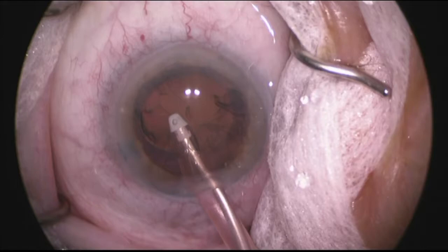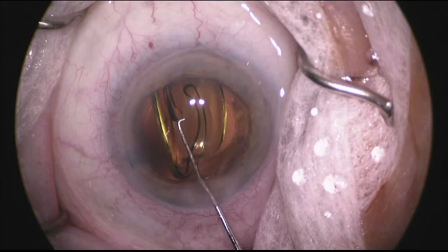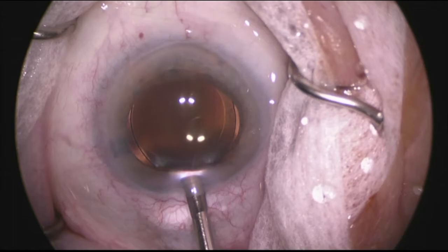The chosen implant is then injected into the capsular bag and rotated into place. The ECP probe is then inserted into the sulcus, and approximately 200 degrees of ciliary processes are treated with 350 milliwatts of continuous wave laser energy.